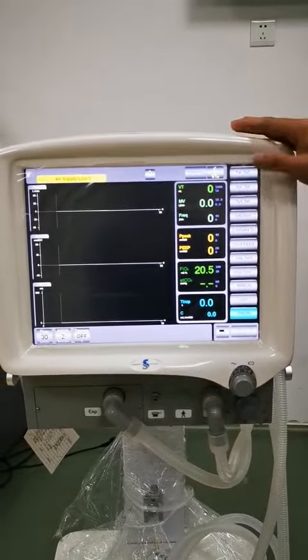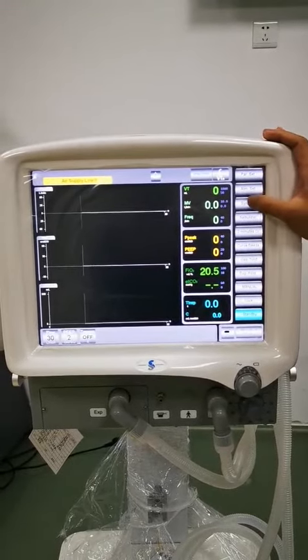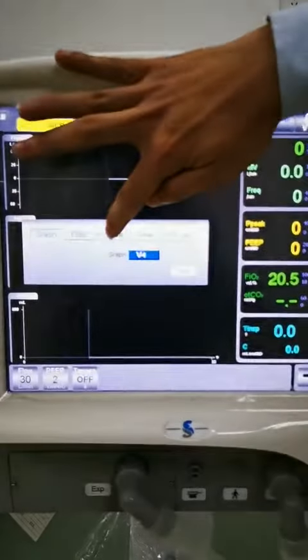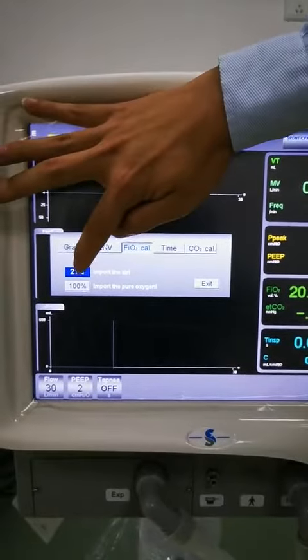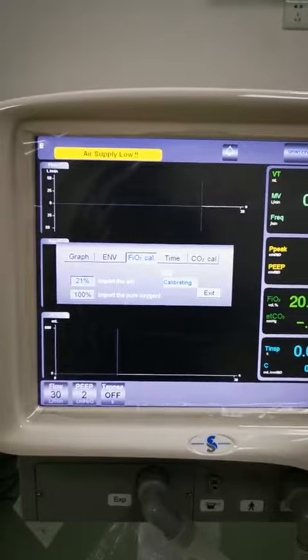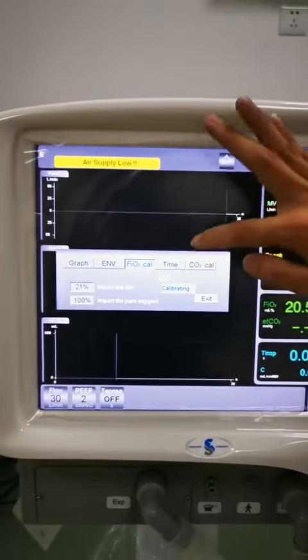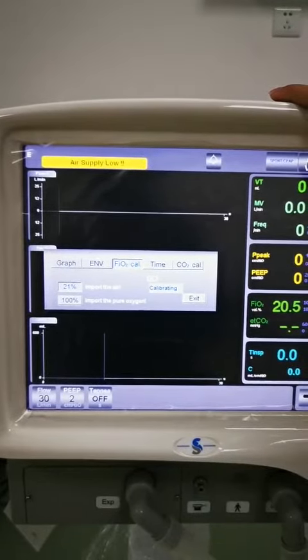We choose the third button on the right side. You will see the system settings — find the oxygen concentration calibration option. Then we press the 21% button and it will perform the calibration automatically. You can see it will finish the calibration within two minutes.